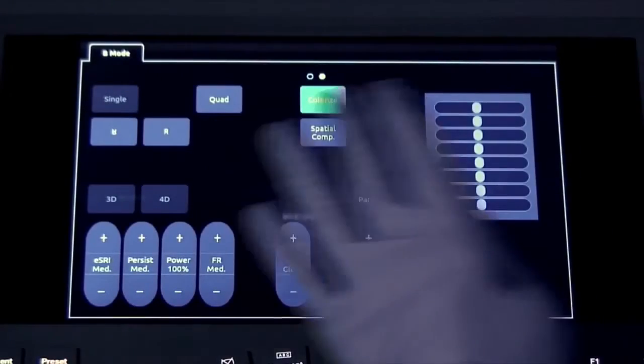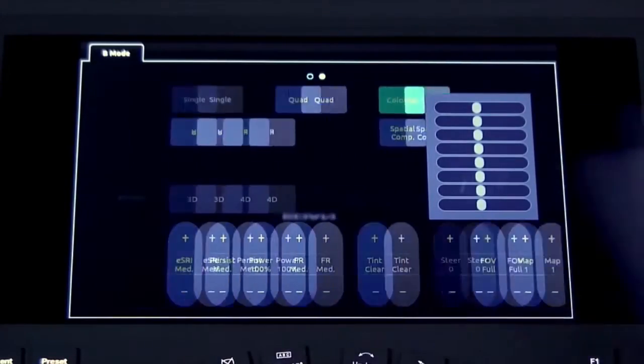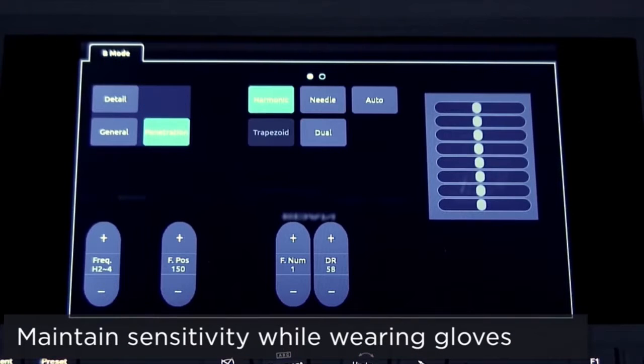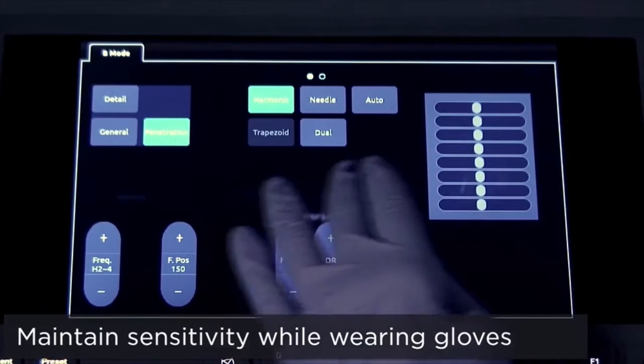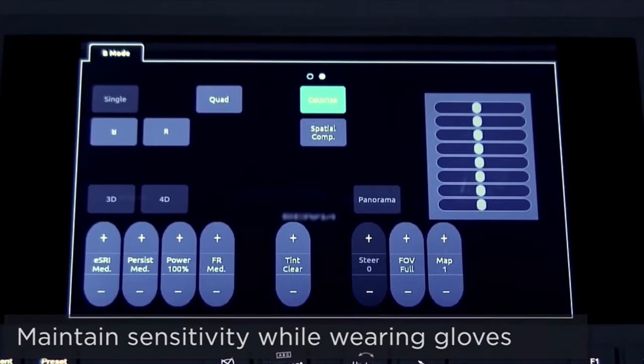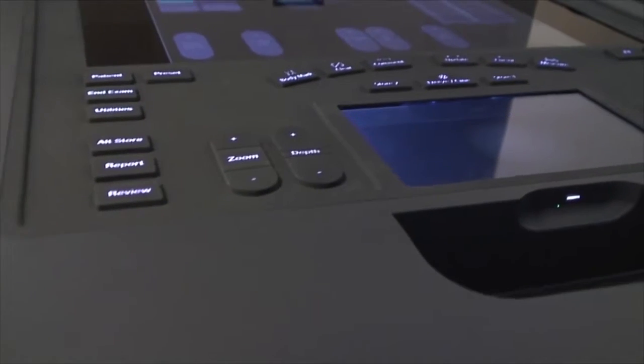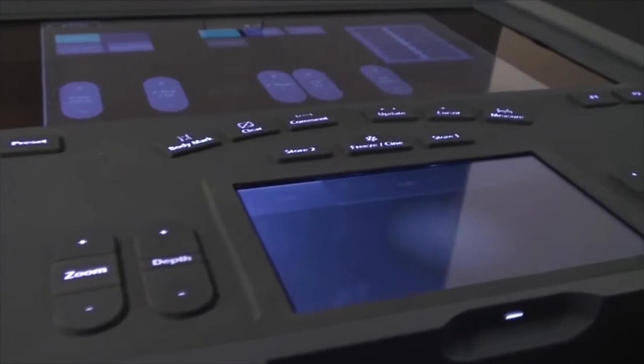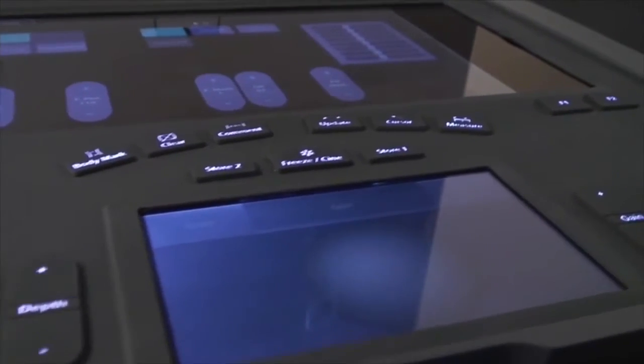The touchscreens were specifically selected because of their ability to maintain sensitivity, even while wearing gloves. The control panel is encased in a durable, siliconized rubber, which wears well for easy cleaning and adds a layer of protection.